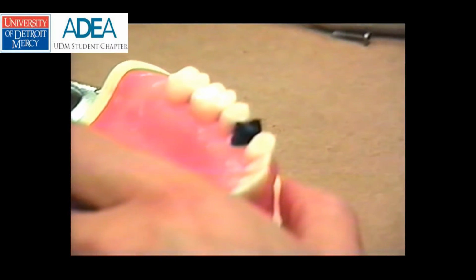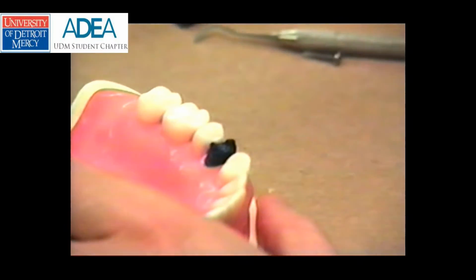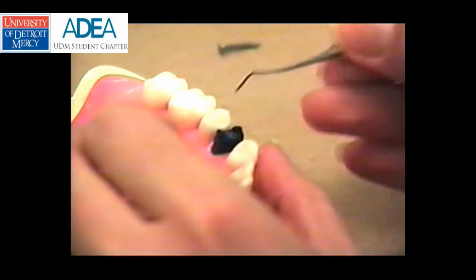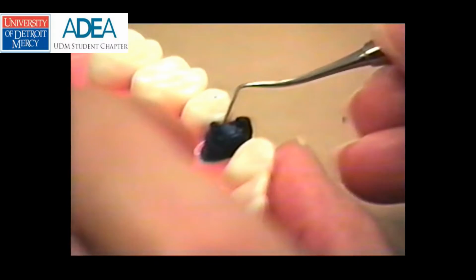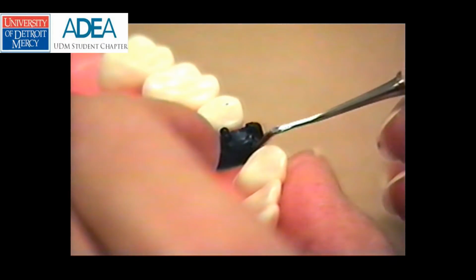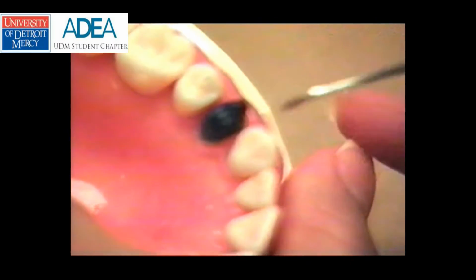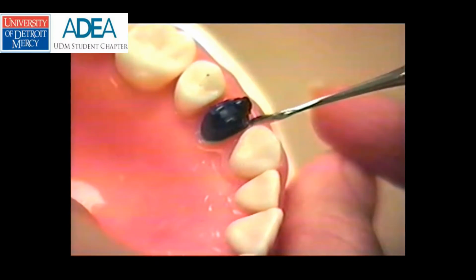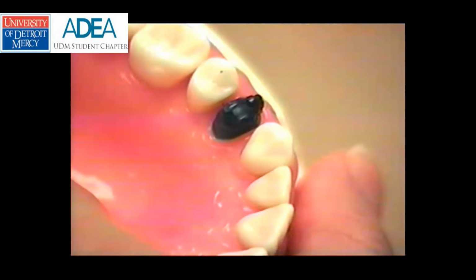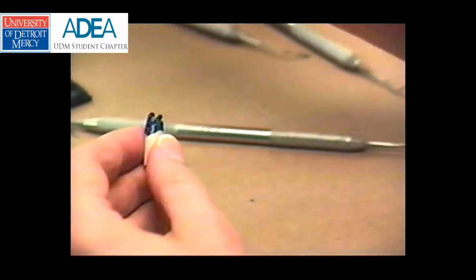Now it's time for us to go ahead and do some proximal contacts and marginal ridges. What you can do is say, okay, my contact is going to be centered right about here. And out here, I can go like this, you can see the contact is pretty facial on the mesial. So what I do is put a little notch in the wax there where I know I need to add wax. And now I just drip a little wax on there and get a contact.